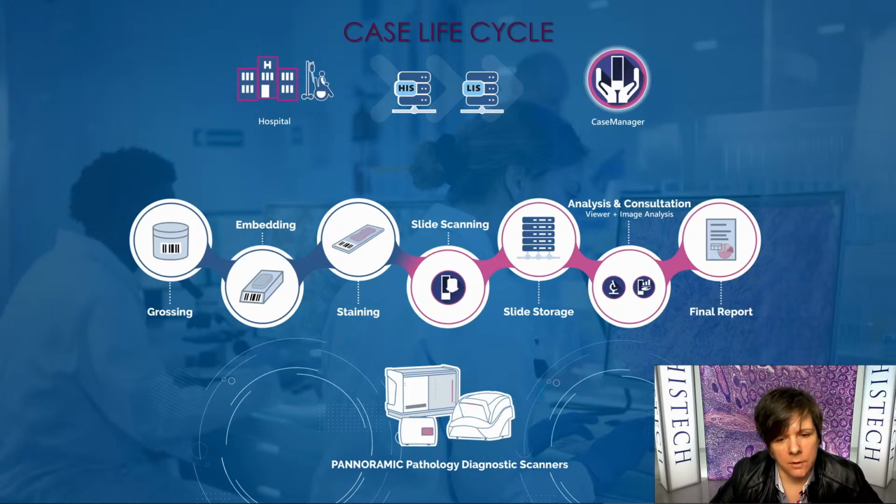The patient data with the diagnosis is sent into the LIS again, and the case manager will store the results of image analysis as well. Additional responsibility for our products is to use a secure communication channel for transferring the data.